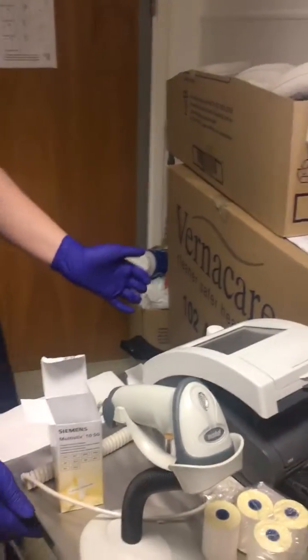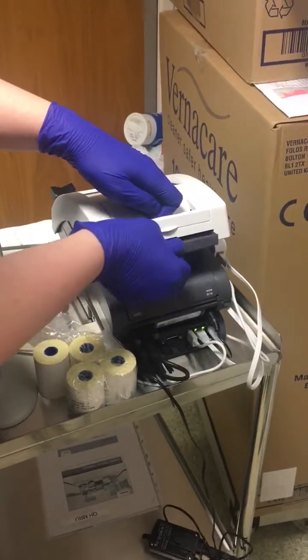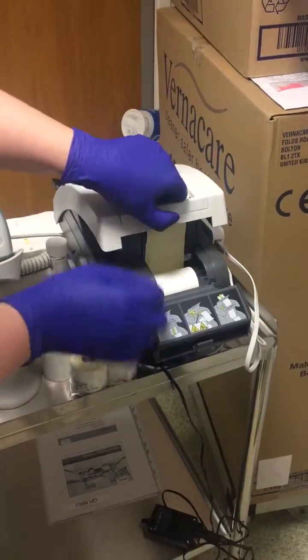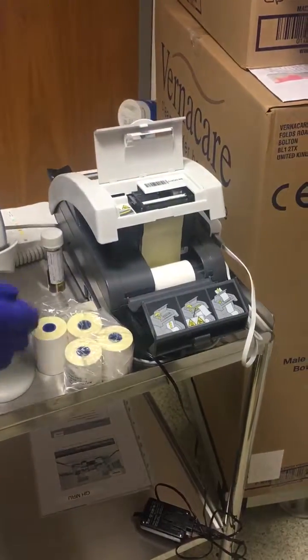I just need to show you how to change the paper on this machine. Open the back compartment like that, and then the top compartment does come open with a little tug.